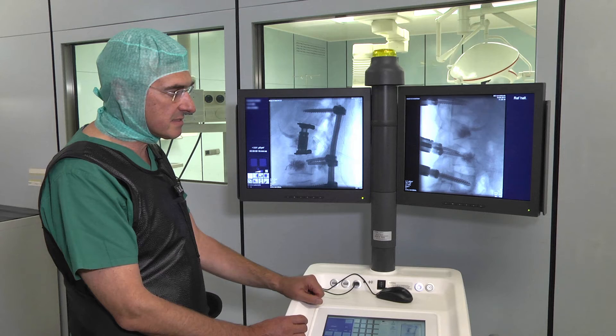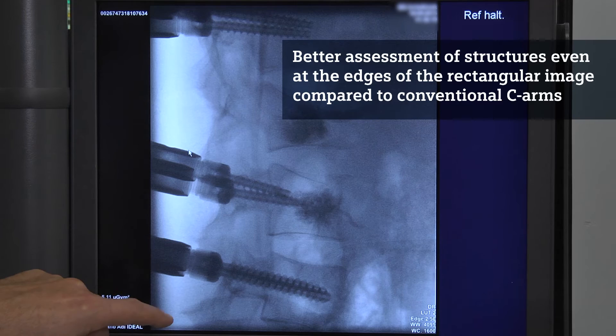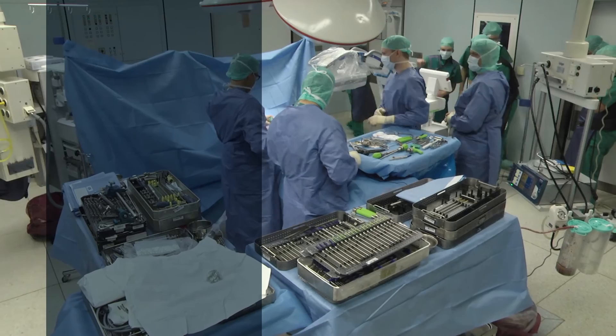It's a good solution to have a rectangular image where you can assess the structures, and it's also amazing right to the edges. That's much better than in conventional C-Arm imaging.